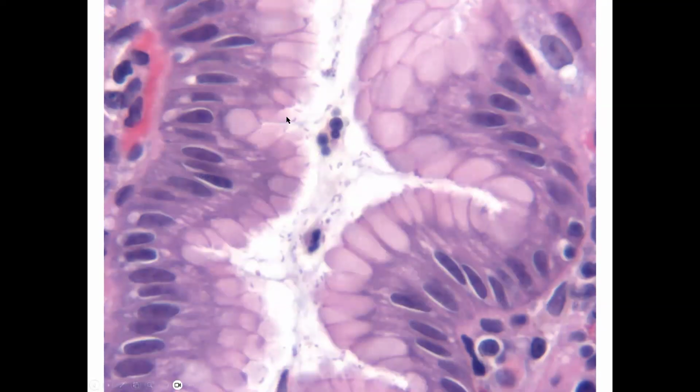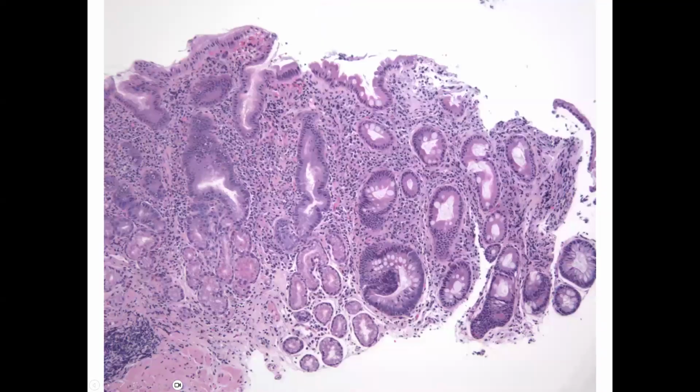When we zoom in on higher power of a lumen in this biopsy, we'd actually see that there are a lot of little slightly curved, almost like a slightly curved C or a rod here. And so this is what Helicobacter looks like. These are many, many Helicobacter organisms here. In this case, there's just so many of them that they show up on an H&E stain, and you can readily identify them without any additional help.